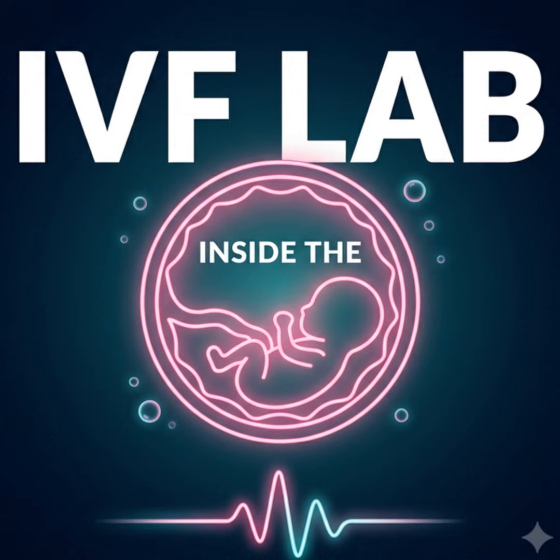Yikes. If that primary responder does not acknowledge the alarm within minutes, the system dials the next embryologist, then the lab director, and it will continue escalating the alerts until a human being is physically en route to the laboratory to intervene. That is serious. We treat a fractional degree of temperature shift as an absolute critical emergency. We do not wait for a tank to fail. We act the moment it deviates from its established baseline.